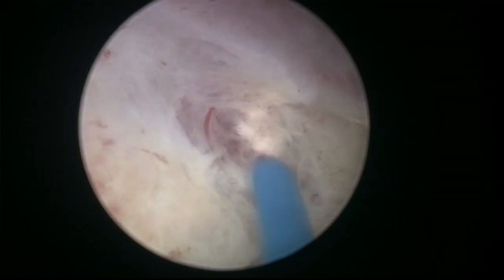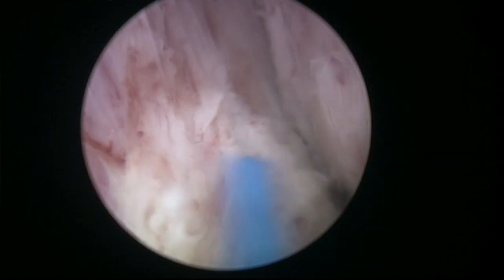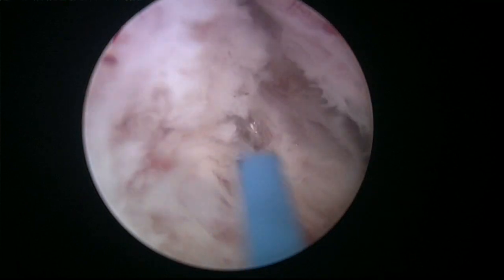The penetration of this energy is very shallow. It's not dangerous to use this energy in the prostate, because it does not penetrate very deep. These are the bleeders you want to get, the ones that are pouring blood into the operative field.